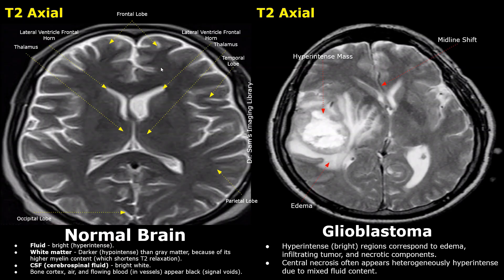On the left, we have a T2-weighted image of a normal brain. T2-weighted images highlight fluid as bright or hyper-intense. The white matter appears darker or hypo-intense than the gray matter because of its higher myelin content, which shortens T2 relaxation.